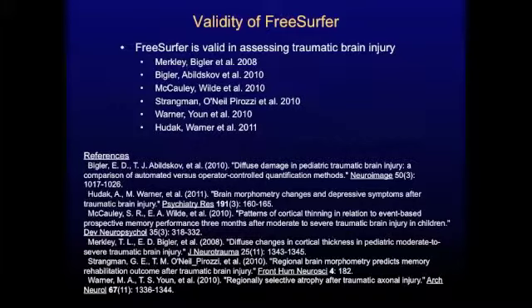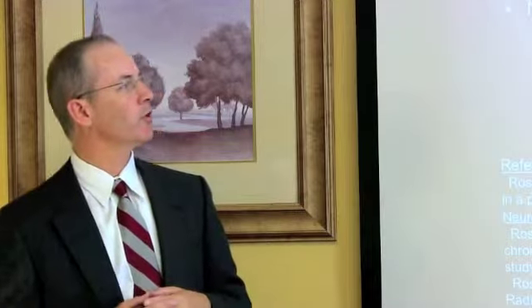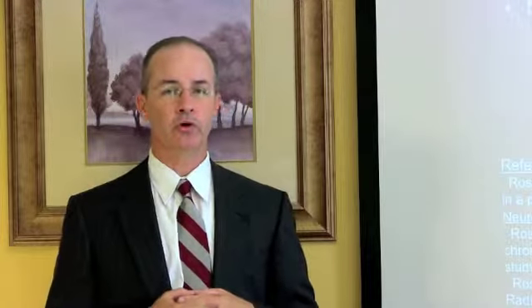Now, FreeSurfer has been found to be valid in assessing traumatic brain injuries. There are multiple studies that have supported that. And NeuroQuant has been found to be valid in assessing traumatic brain injury. We have 3 published or in-press articles in the scientific literature that have found that. To my knowledge, these are the only 3 articles looking at NeuroQuant and traumatic brain injury so far. And I'll tell you more about those articles during the remainder of this talk. We'll get into those in some detail.